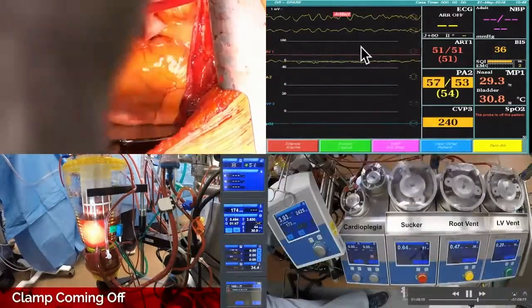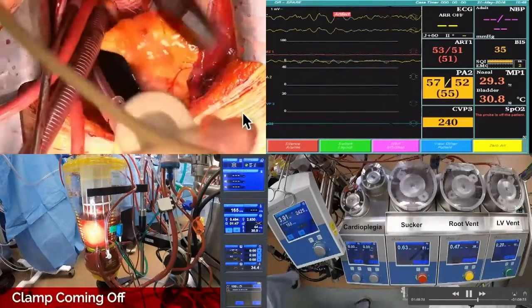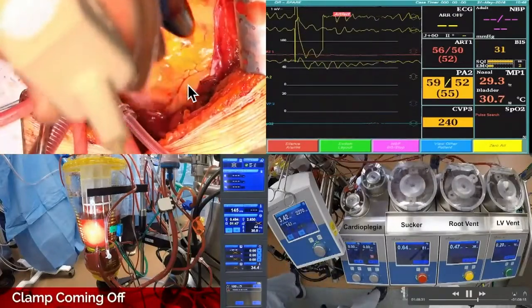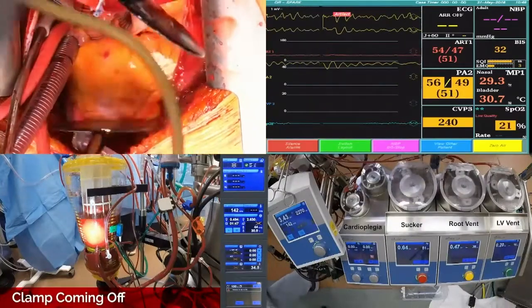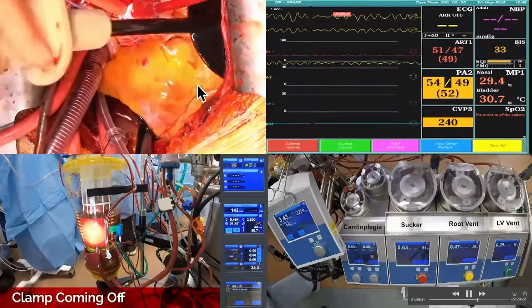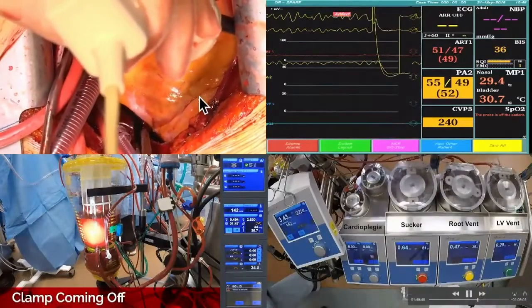Defibrillate it, because you've got fibrillation. LV vents are on. Those are the paddles. Yeah, see the paddles going in, and watch the heart jump. Watch it. Oh, didn't see it. Oh, going to do it again. Well, I did it again because I gave it a cheap shot. Okay, let's watch it. They're charging it. You can't hear it, but it's going. Big, thick heart. Pop. See the pop?